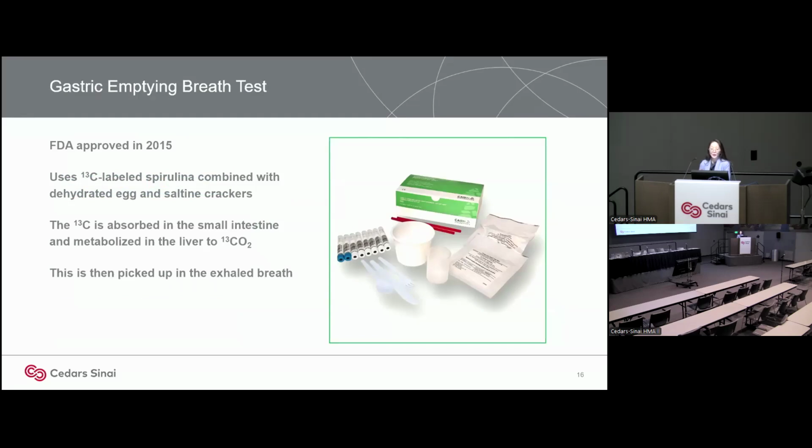Speaking of gastric emptying, I wanted to remind everyone that we also have available in our clinic a gastric emptying breath test. Not a new test. It's been around and FDA approved for over 10 years or so, but we started offering it in our clinic a couple years ago, especially with the long lag time in getting patients in for the nuclear medicine scintigraphy.